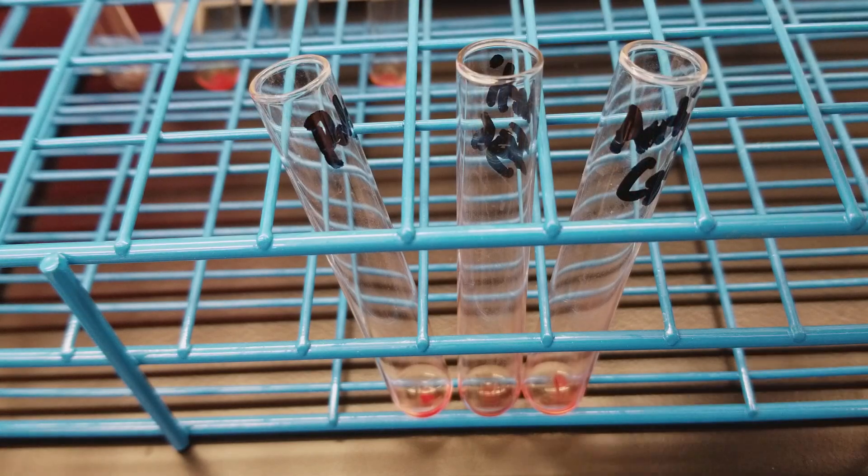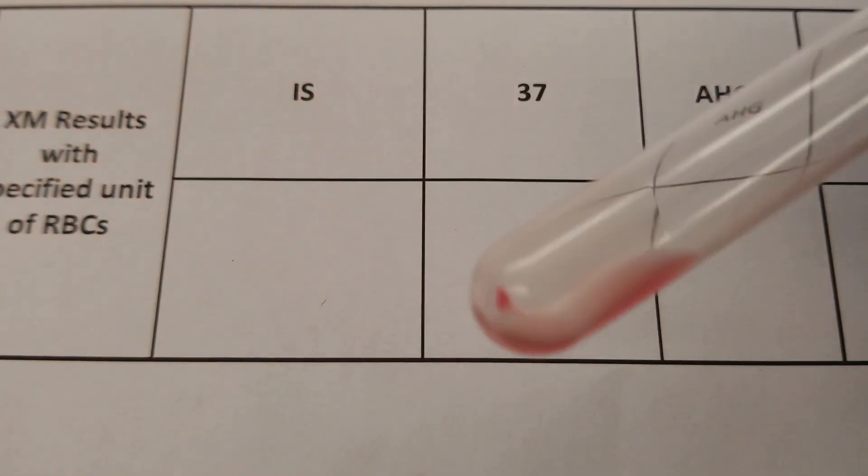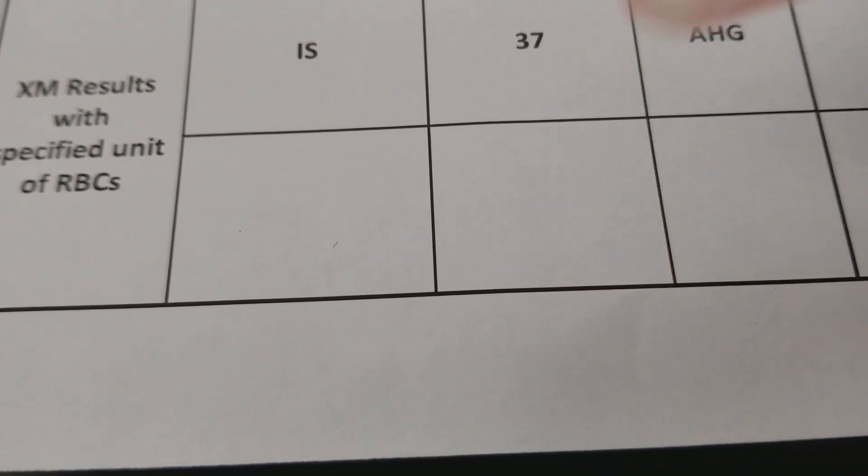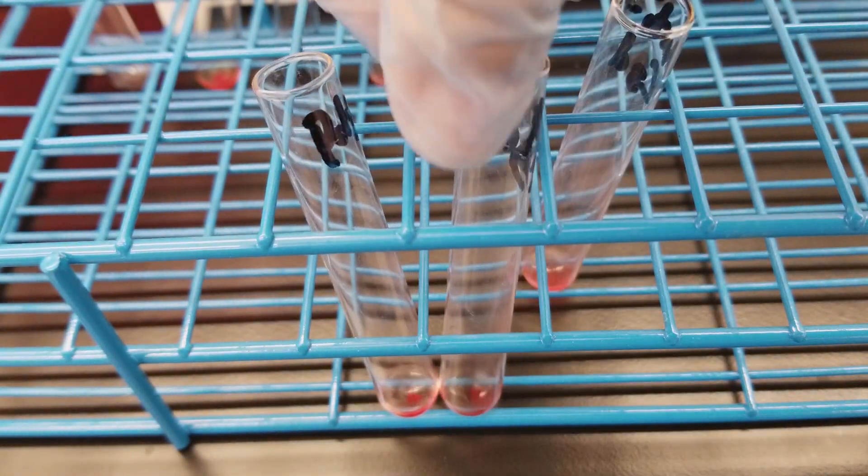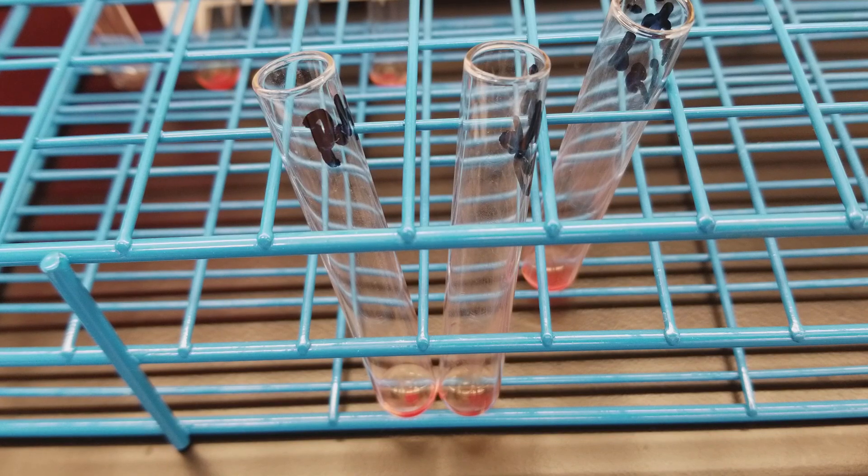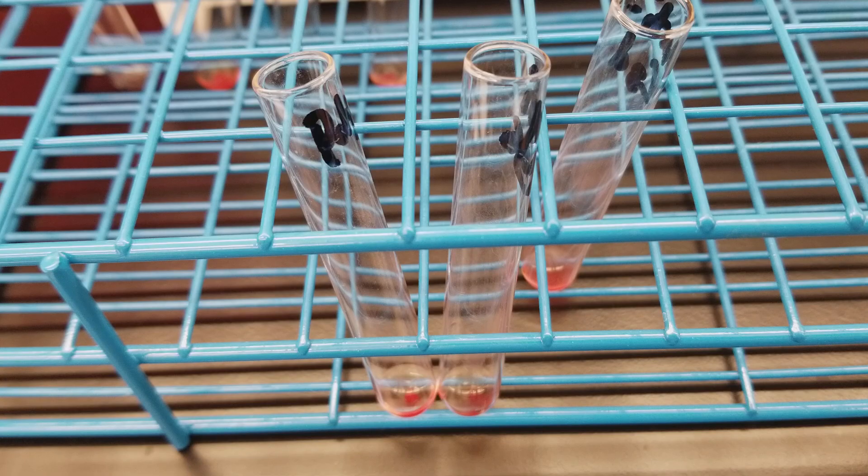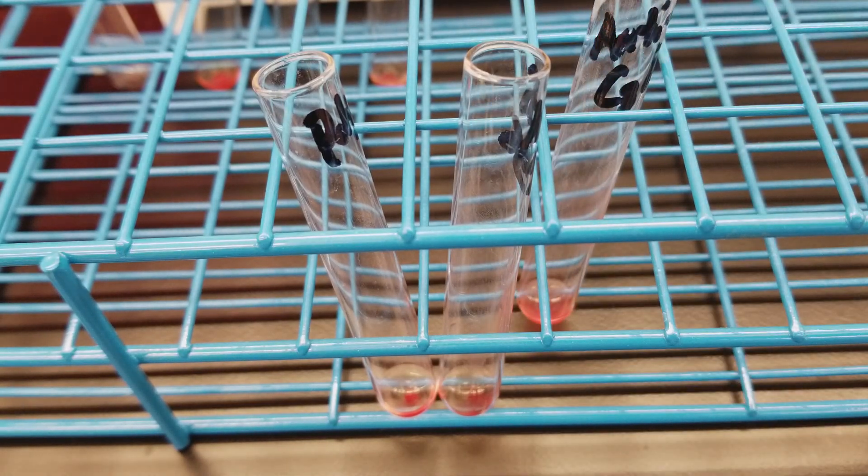And then let's see the complement. The complement is negative. So that means we are expecting that it was the IgG that is sensitizing the red cells, also known as coating the red cells. So what I'm going to do is add check cells to this anti-C3D since we had a negative here.